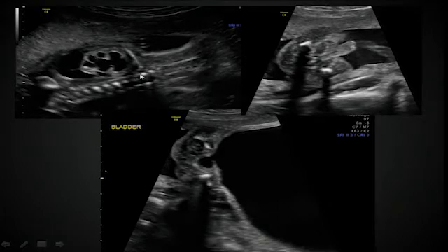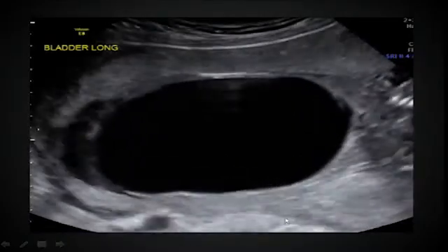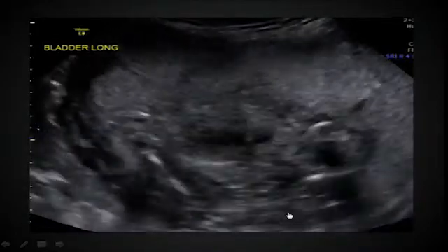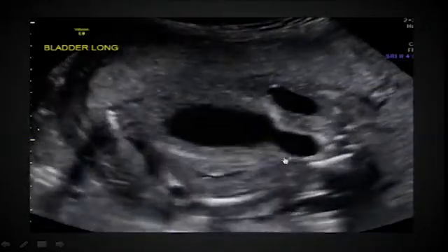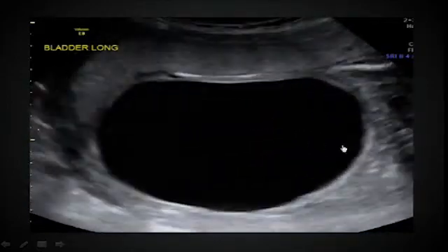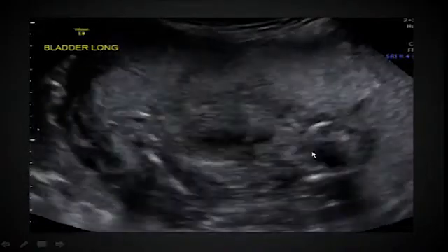One of the things that can happen is you can actually get rupture of a ureter, a hydroureter, or the bladder itself if there's enough pressure in there. But look at this. Now this is looking at the bladder, so we're telling you it's the bladder coming down into the pelvic area. See this? And then in real time. Now look at right here. This is classic for this abnormality.